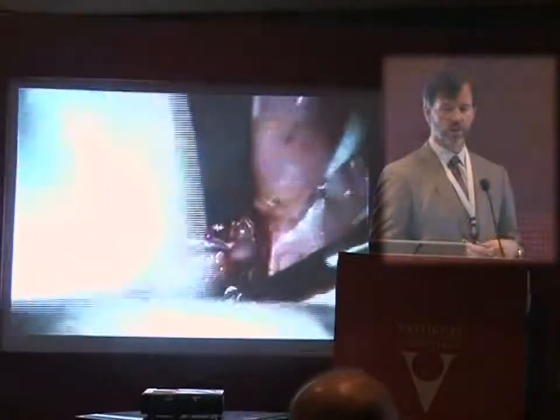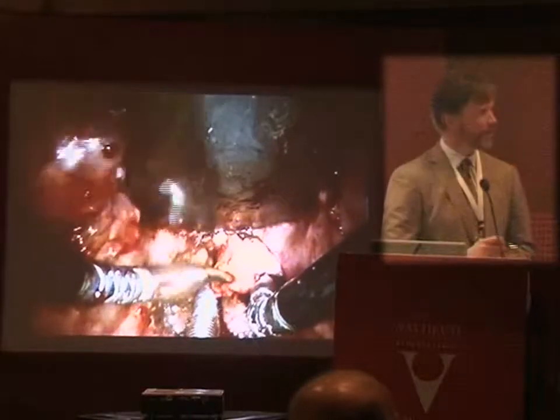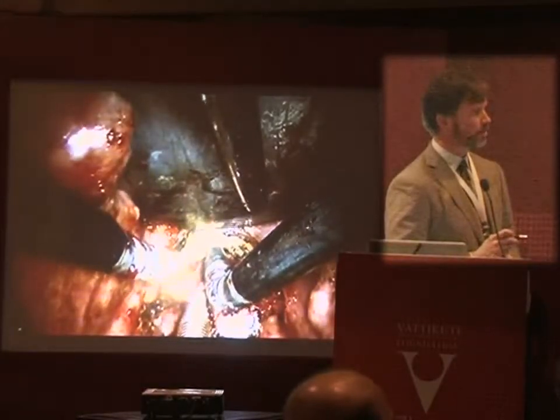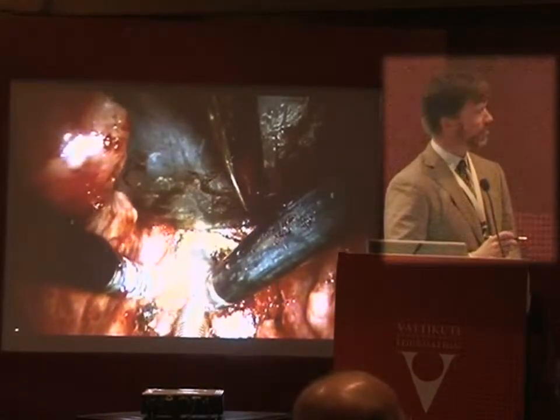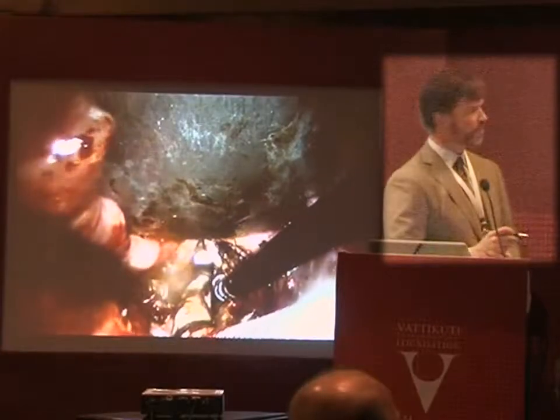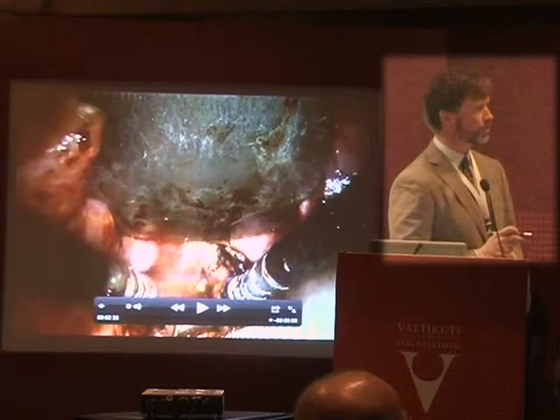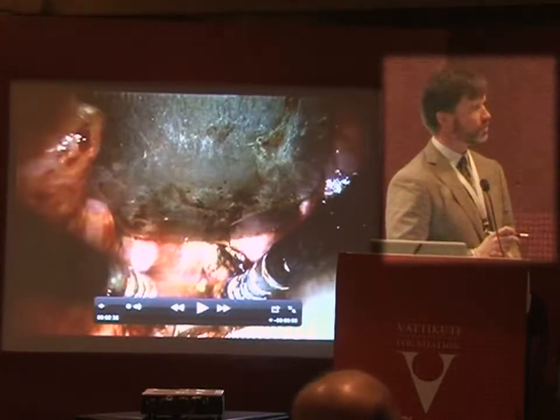The en bloc resection allows for both a direct incision approach and an outside-to-in approach. Here is removal of the tumor and epiglottis, then I come back and excise margins from the patient. The specimen was oriented. I'm taking margins from the paraglottic space — these are the false folds being resected. The thyroid cartilage comes all the way out to this edge. There's some condensation on the scope blocking the view, but I have a binocular camera and can proceed. Here is the final view of the glottis: the laser tube and the cords, with the resection carried all the way into the ventricle on either side — a full supraglottic laryngectomy, remaining only with the arytenoids and true cords on either side.